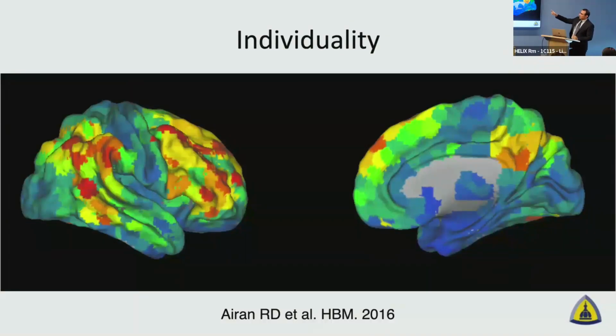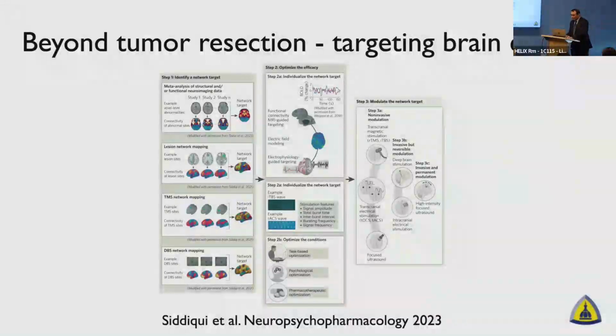Whereas the orange, yellow, red are the areas that had the largest effect on pairing the scans together. Those are all the association areas, which again makes sense, since association areas are higher cognitive function, right? And can determine more individual features.